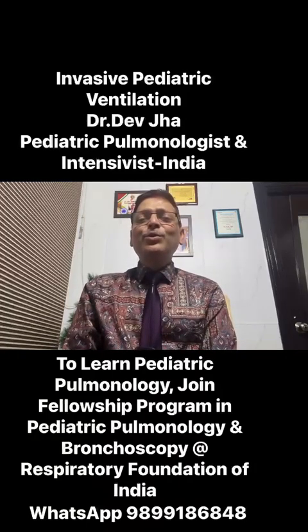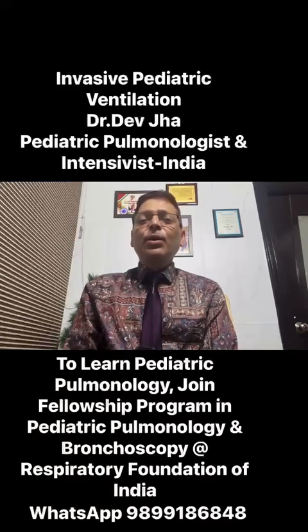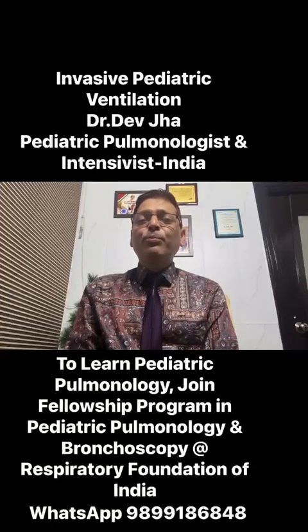Today I am going to describe in short the basics of mechanical ventilation. So what is the difference between spontaneous ventilation and mechanical ventilation? The only difference is spontaneous ventilation is a negative pressure ventilation where air is sucked in from the environment into the alveoli, and mechanical ventilation is a positive pressure ventilation when we push air into the lungs.